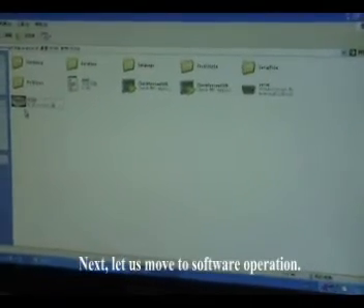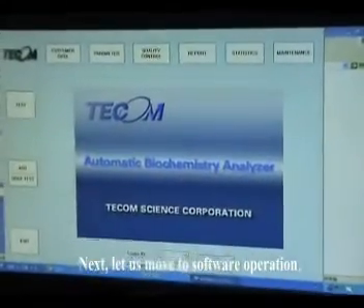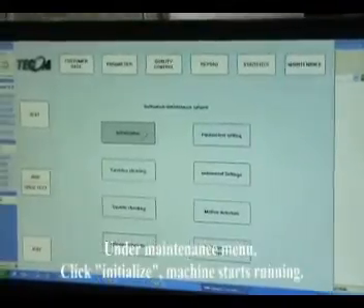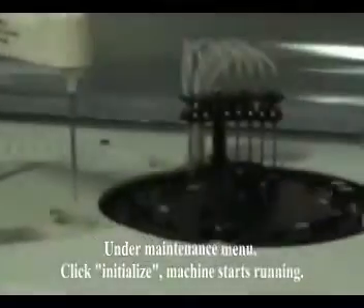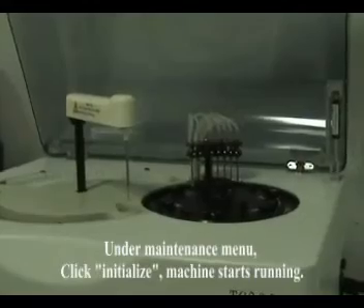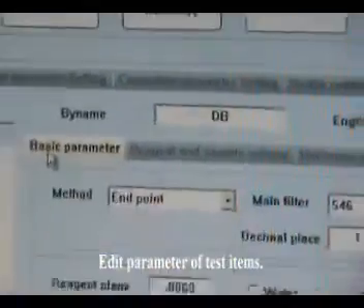Next, let's move to software operation. Under the maintenance menu, click initialize — machine starts running. Edit parameters of test items.